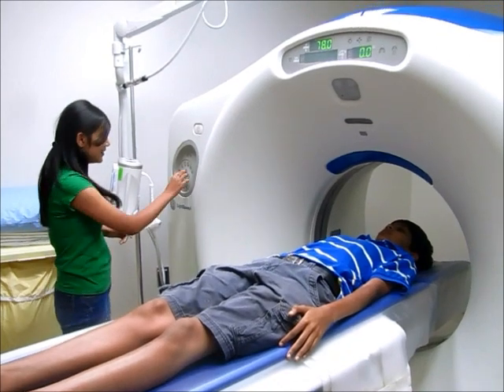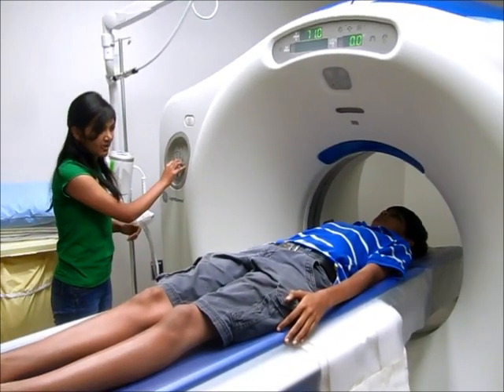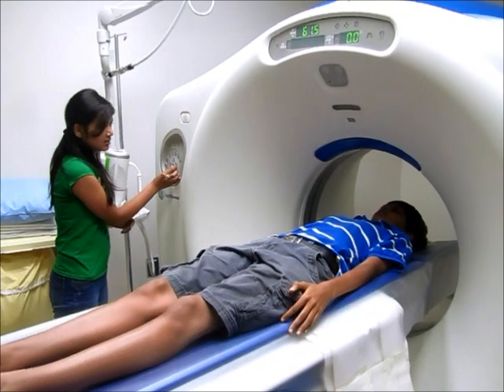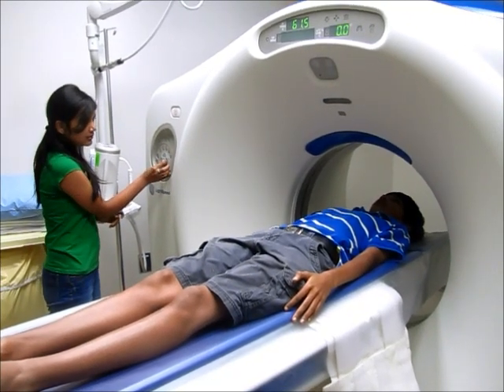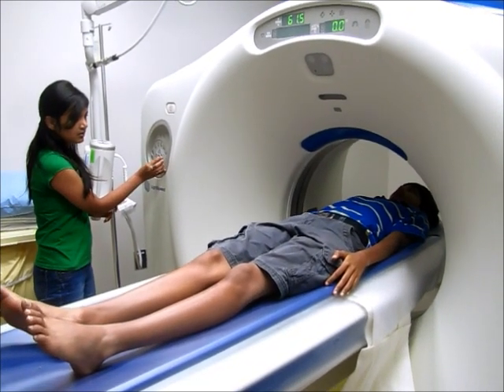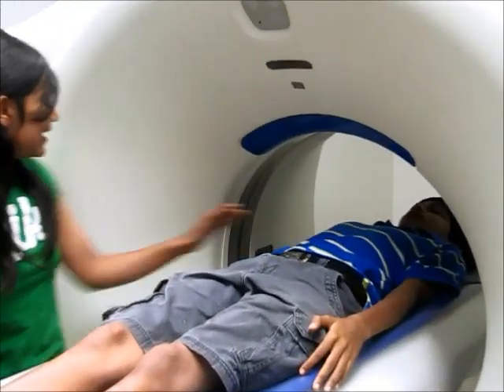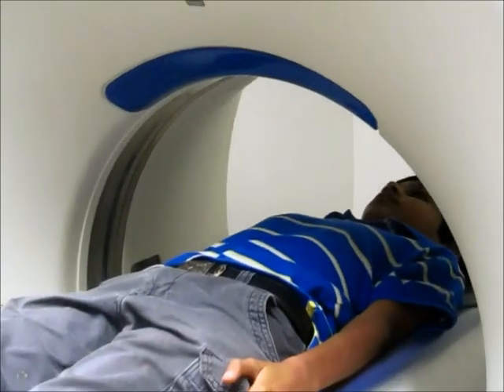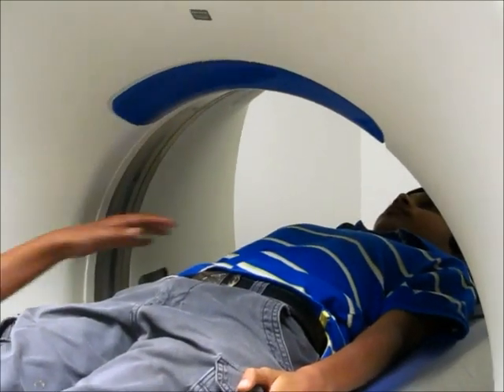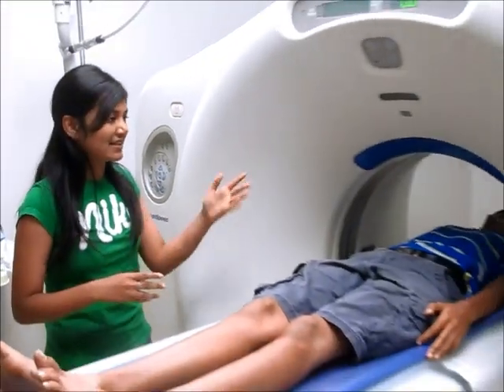And now I'll show you how to look if you had something wrong with your stomach. Now his abdomen is inside the CT scan machine. And this part would take a picture of his abdomen. And then if he had something wrong with it, the doctors could tell because they could see the picture after they take the picture.